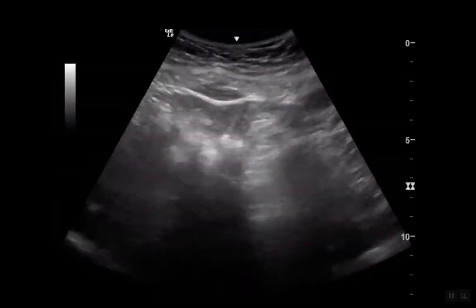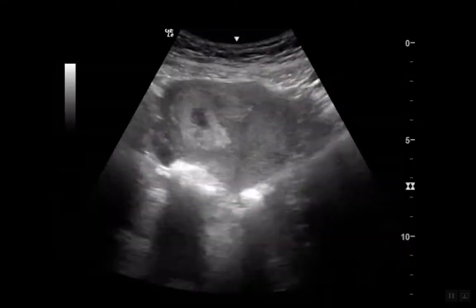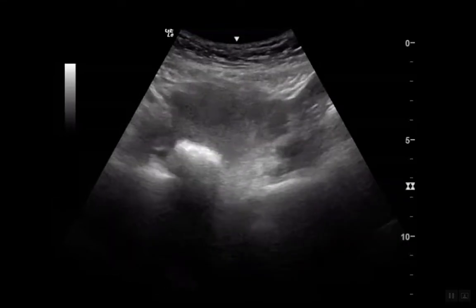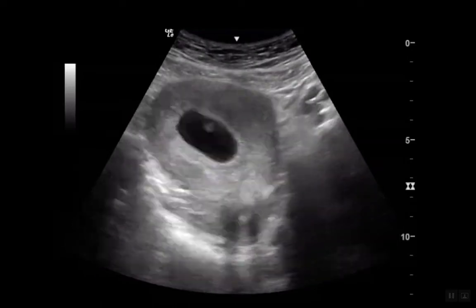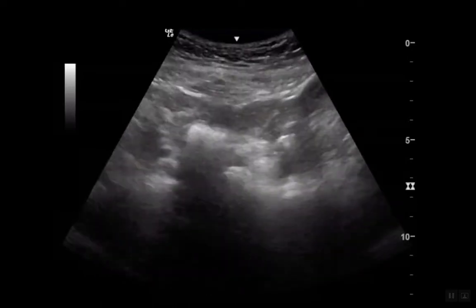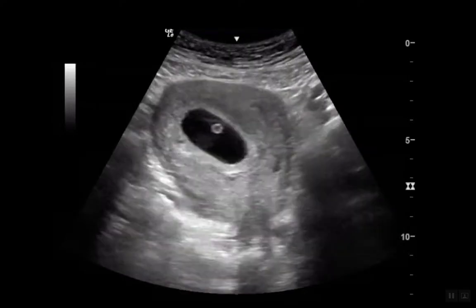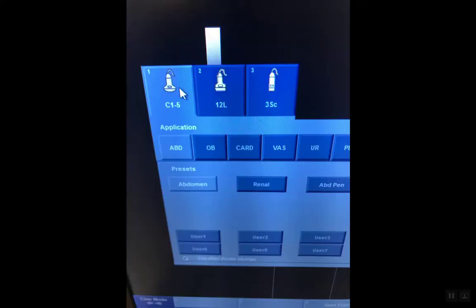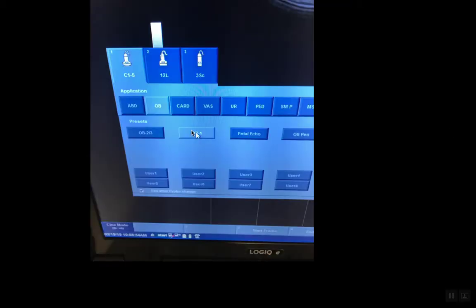This is a quick tutorial on how to use M-Mode to measure the fetal heart rate when doing OB ultrasound. We're not going to go over how to do OB ultrasound — only focus on using M-Mode today. Whether you pick a preset that is the ABD abdominal or OB first trimester, it doesn't matter. You'll still be able to do the correct procedure and the necessary calculations.